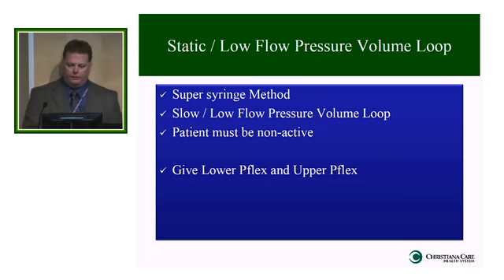Then we realized that if you use the ventilator, you can slow the flow down low enough, or the theory was that if you could slow the flow down low enough, you could do a maneuver on the ventilator without disconnecting them. It could be more automated, and then they could go back to their normal ventilation after the fact. And so I'll mention that, and that is another method that would be a slow flow or low flow pressure volume loop.